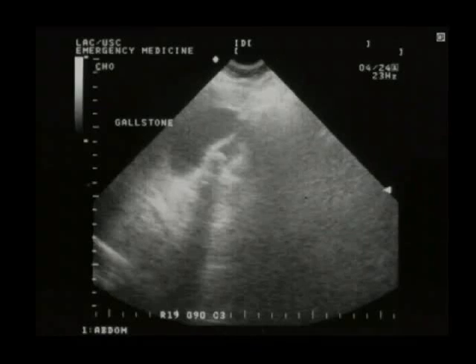What is bowel? We're going to see it tomorrow in the lab, but it's going to be indiscreet. It's going to be very difficult to image. Bowel is full of air. You just don't see anything, basically. Occasionally, you'll see peristalsis if there's fluid within the bowel.